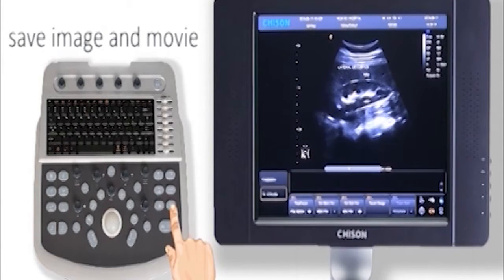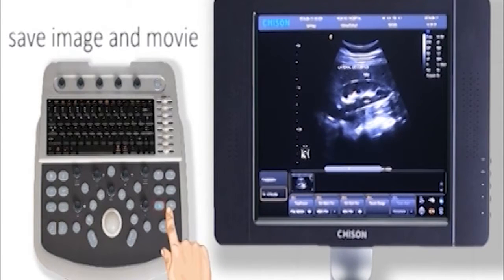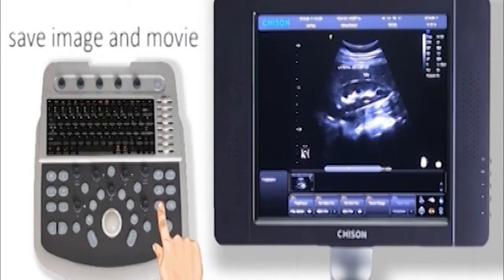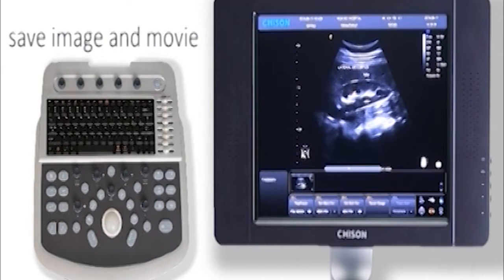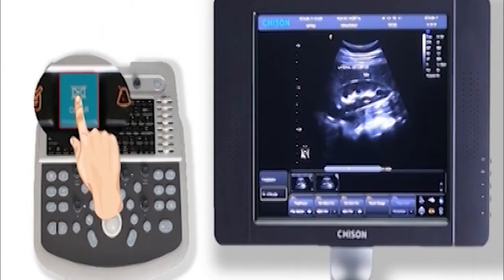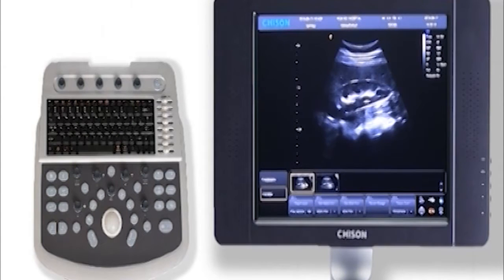Press this key to save still image. Another key is to save movie. They will be displayed at the below area. Press the clear key to delete wrong measurements and comments.